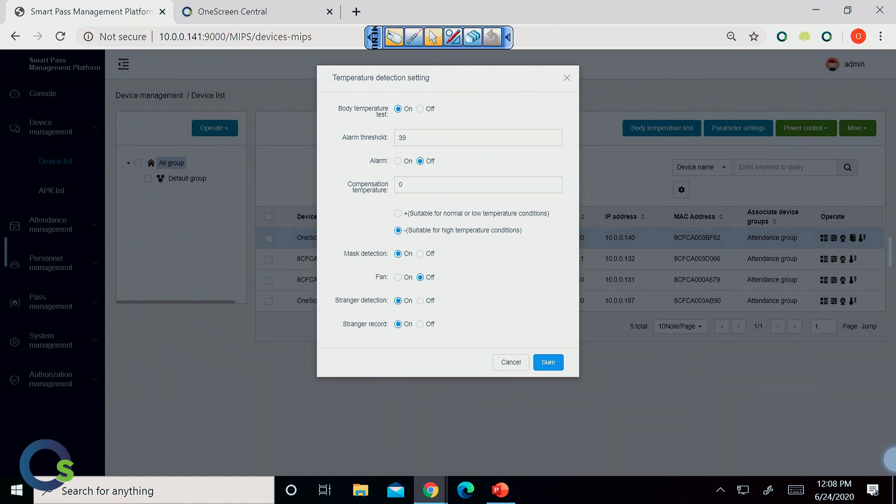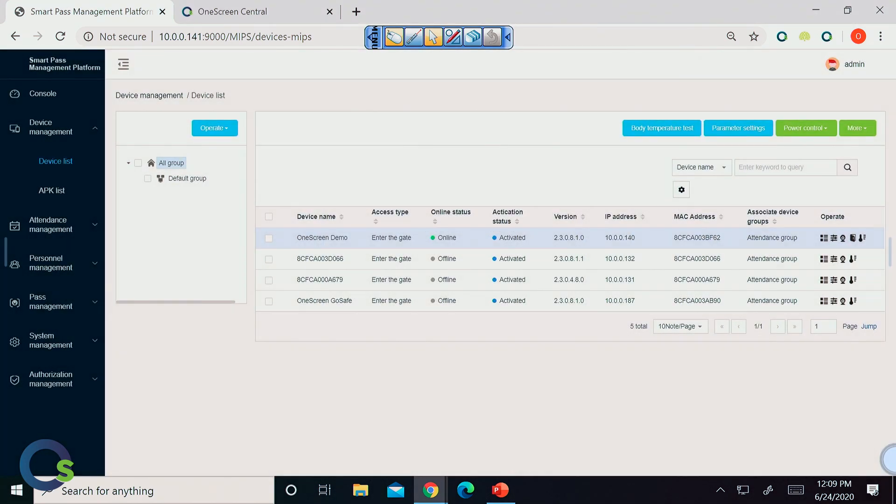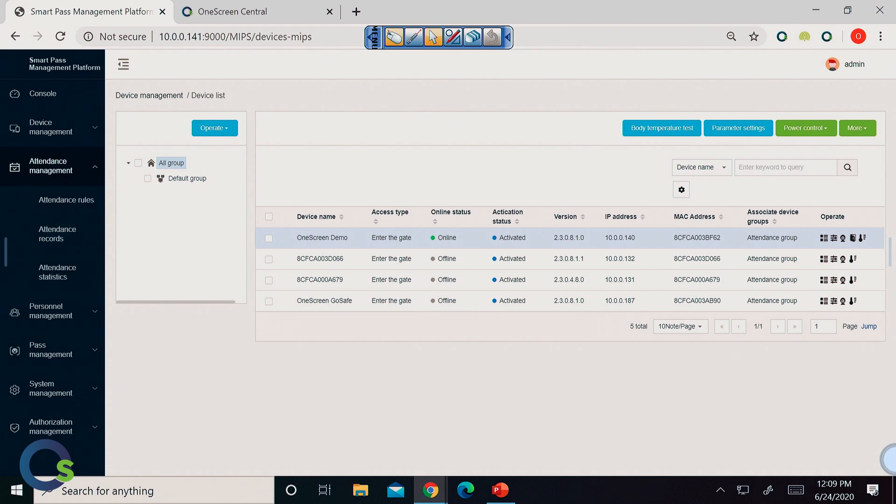We can choose whether or not we want the body temperature test on or off, what the threshold is in terms of temperature, whether there's an alarm that goes on, and there's compensation for temperature — so if it's extremely hot or cold outside, you can adjust for that. Down at the bottom is where all the mask detection settings are, having a fan running especially in higher traffic areas, stranger detection, stranger record — all that can be done right here through the management portal, which is a huge reason why we recommend using the network application.